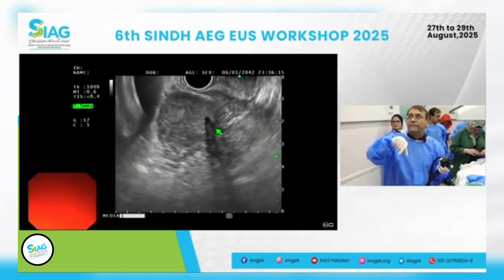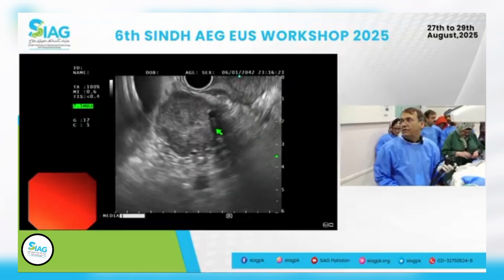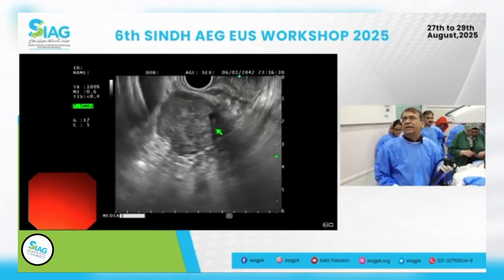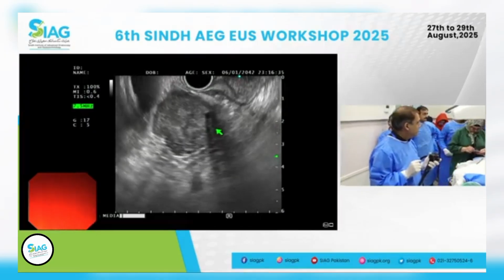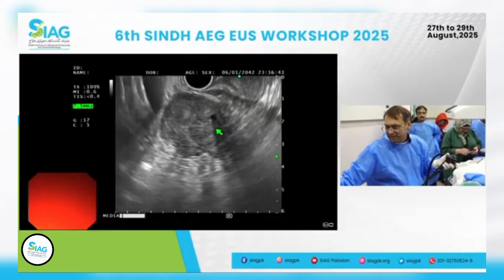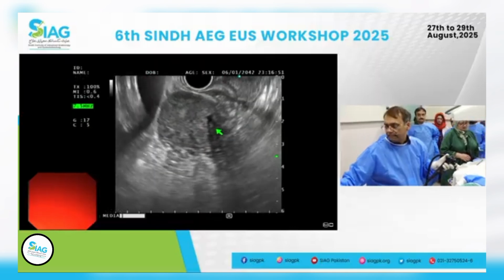There's a comment from Nadeem: this being melanoma, the cells or the tissue are less likely to come as a full core because the cells are not cohesive. Yes, correct. And also now when you've gone in and applied suction, from here it looks like some of the tumor area has turned a little white, right? So now that you're applying suction, how do you go about doing the second pass?